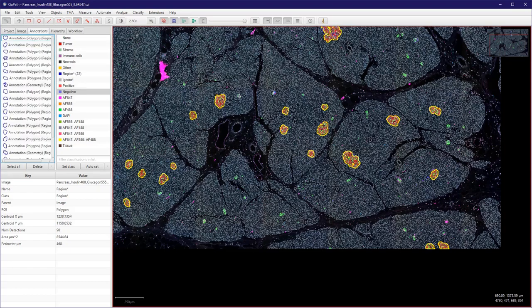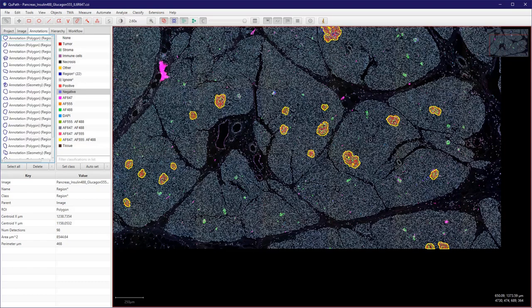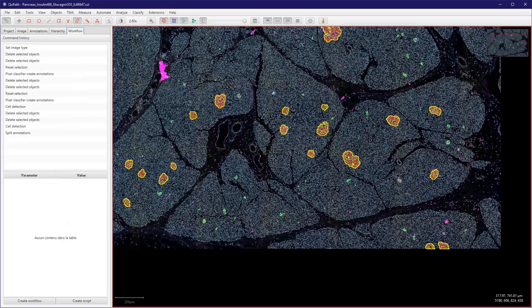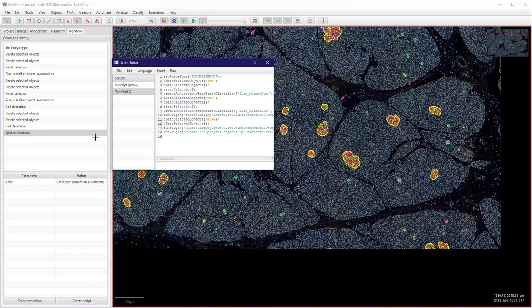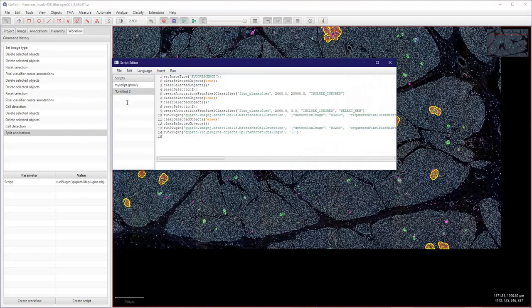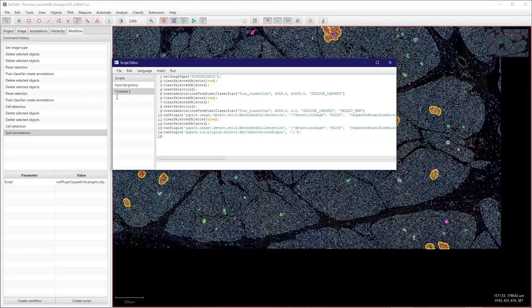So for instance we could split the annotation here. And if you go to workflow, split annotations here has been added. So this is a command that you could add. So if I click on create script here, it's actually another way to do it. It's just the last line here.